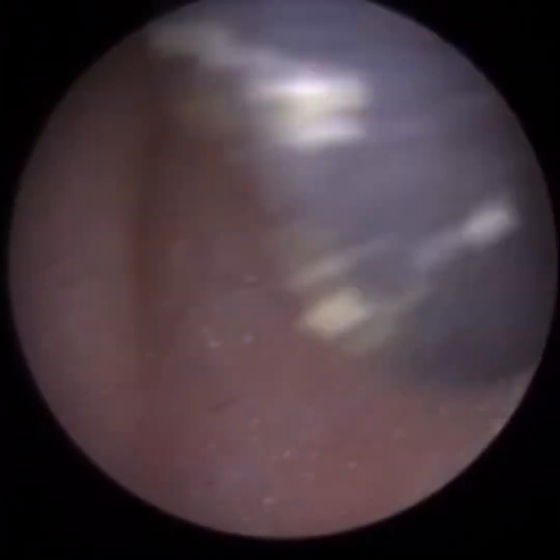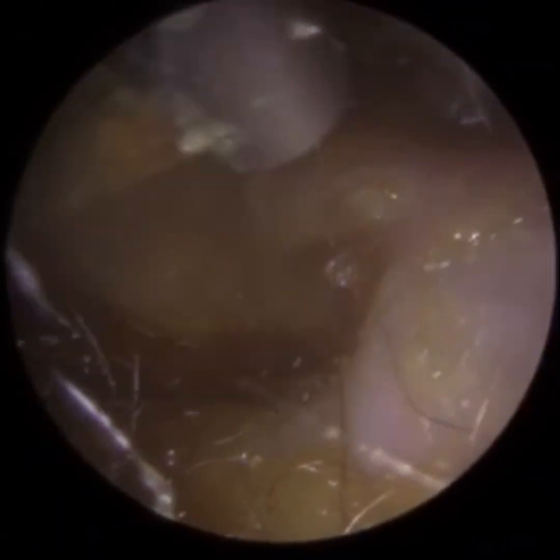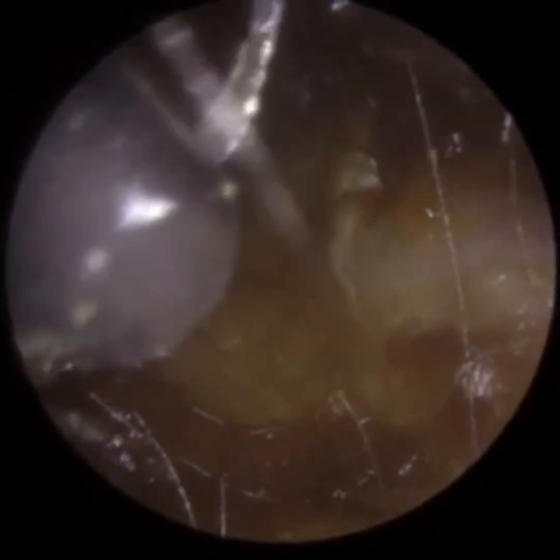What you're going to be watching whilst I'm talking is me just using a fine end suction tip to just peel skin. There's no wax, it's just skin, and it'll all come together. If you continue watching and listen to my narration, hopefully it'll all make sense what we're doing and why we're doing it. So what is a mastoid cavity?